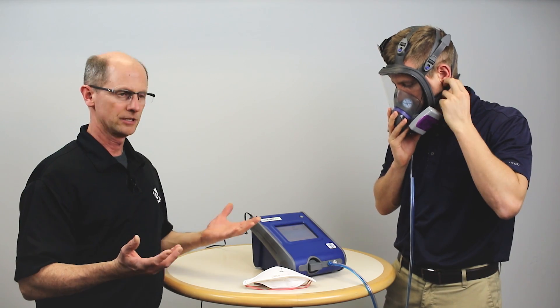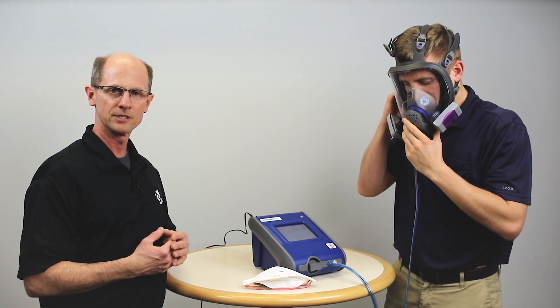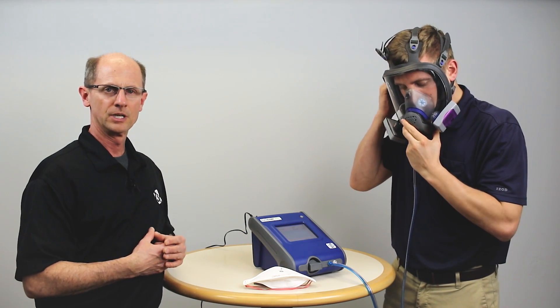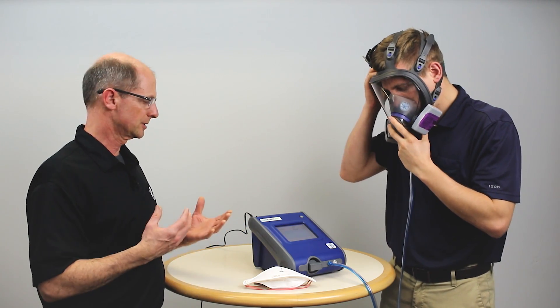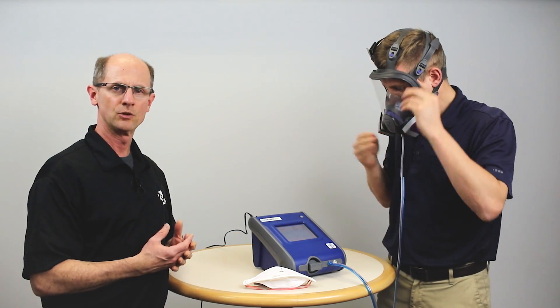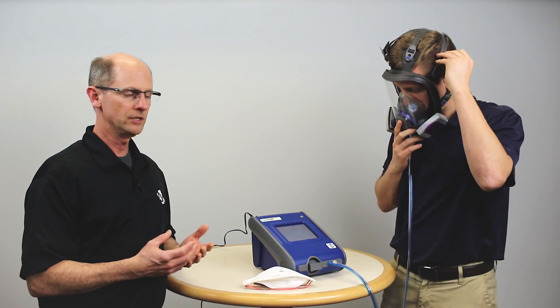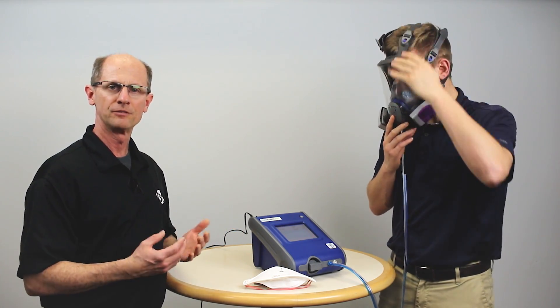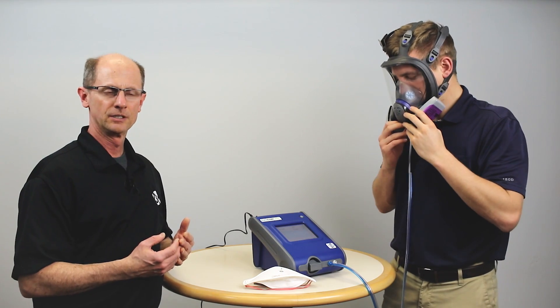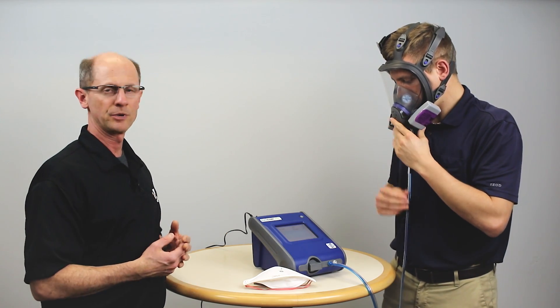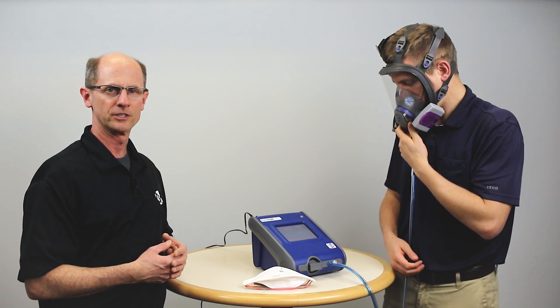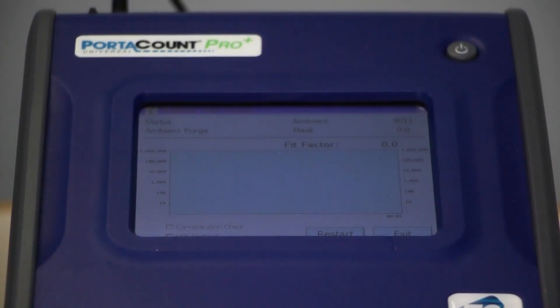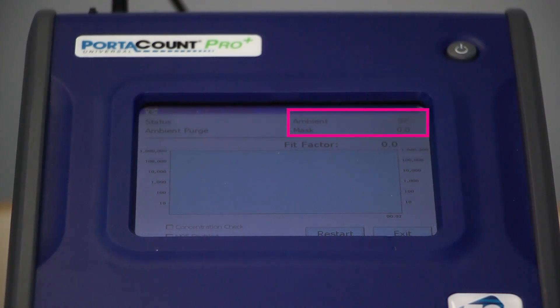As Ben makes his adjustments, the instrument is doing an ambient measurement like in a fit test, and then it's going to measure from inside the respirator. We'll get a display pretty soon, and we're looking for the display line to stabilize above 500 — for this respirator, we want a fit factor of 500.